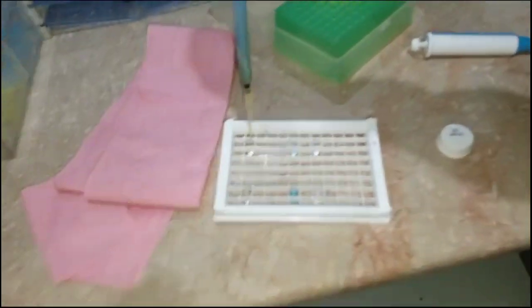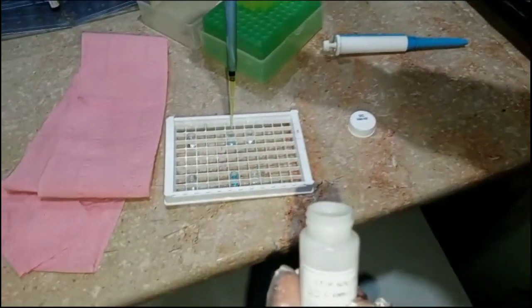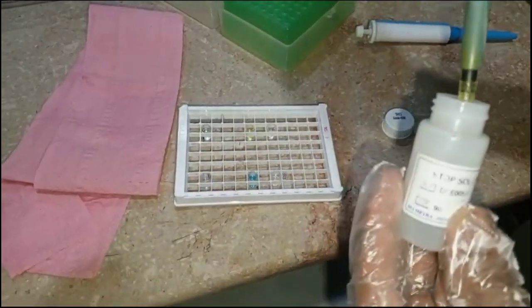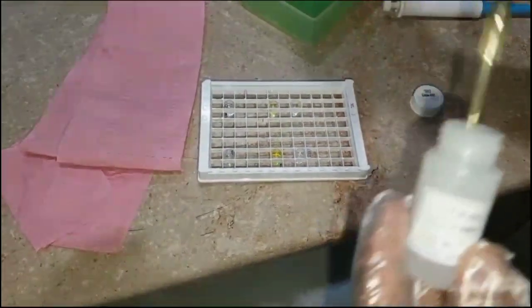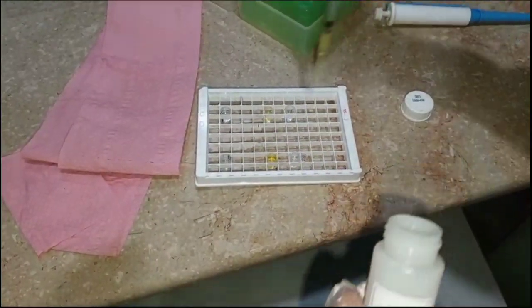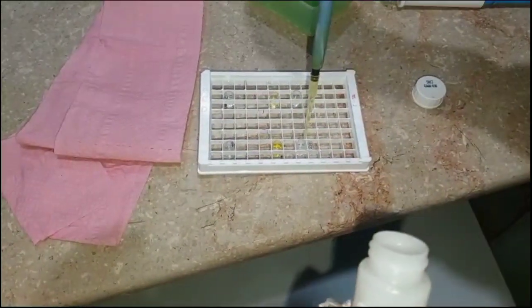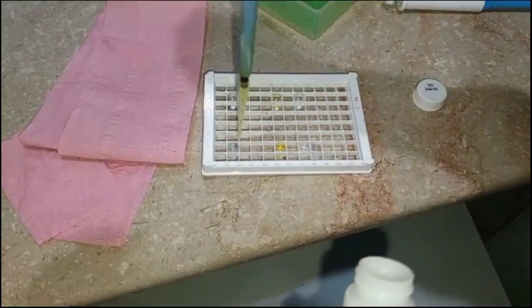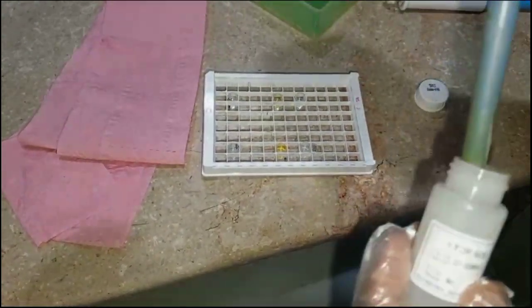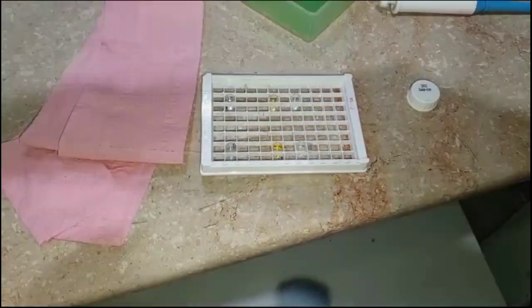So after that, what should we do? We have to add a stop solution. We should add 100 microliters of the stop solution. The main purpose of this stop solution is to stop all the reaction, the enzyme and substrate reaction, and it can also stop the over enhancement, etc. And it can also ready or make the ELISA for reading as well. So this is the main purpose of the stop solution.